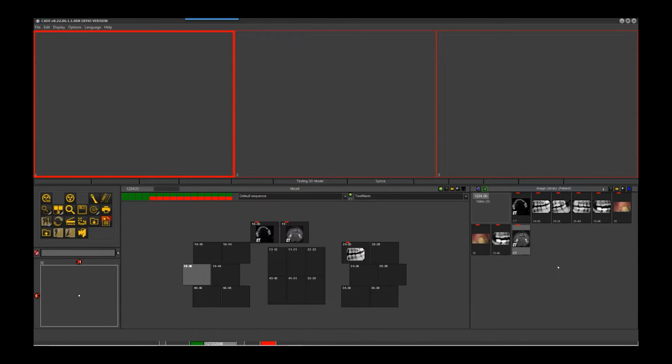So when you're in the patient chart, you can see a thumbnail of those images. That is something that needs to be done by Open Dental. Which means there's some weird voting thing that you have to do in Open Dental to get stuff like this done. It's super weird. Yeah, it takes requests. The squeaky wheel gets oiled, and the more requests they have for it, the sooner they'll put resources to do it. It's about 2 weeks of programming time and maybe another week of beta testing.